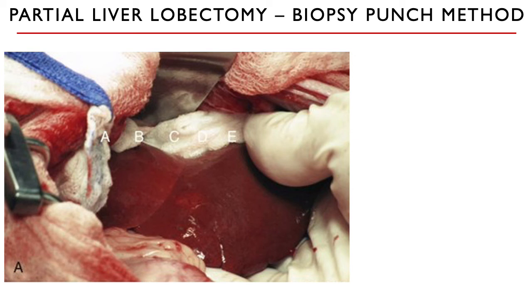You see the liver. You see this area here where it is lighter in color than the rest of the liver? You see this one? My laser is there. I'm going to remove the laser. Okay? See that? Now, you want to take a biopsy of that to find out what it is. Could it be a starting tumor? Could it be a cyst? And all that. So you want to remove that part of the liver.